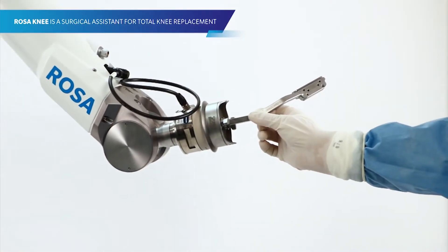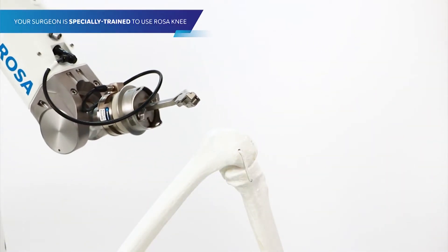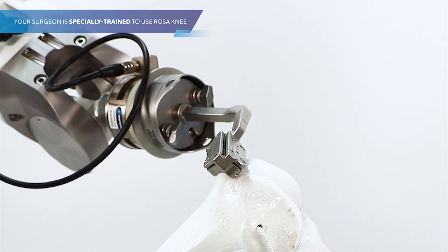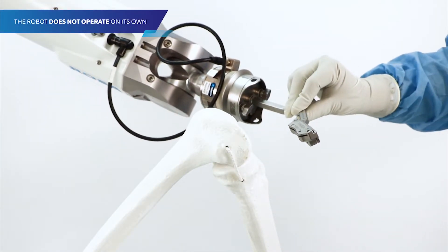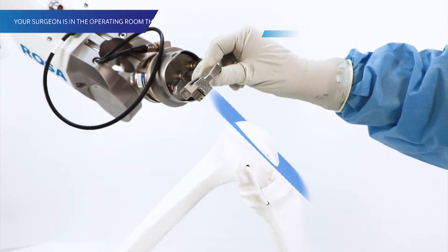Rosa Knee is a robotic surgical assistant for total knee replacement. Your surgeon is specially trained to use the robot. Rosa Knee does not operate on its own. Your surgeon is in the operating room the entire time and making decisions throughout your surgery.